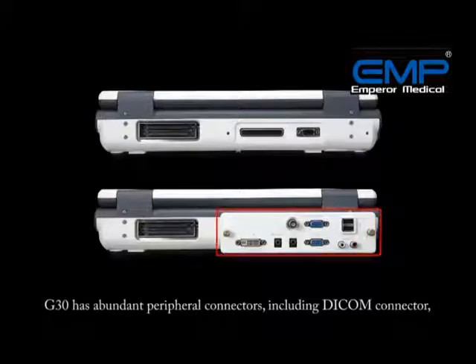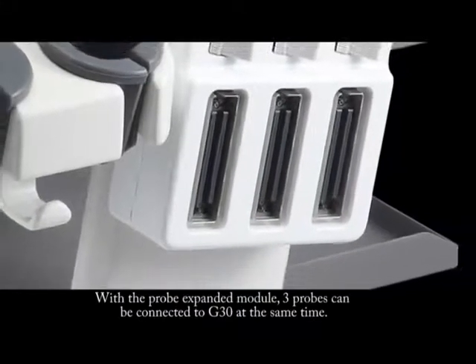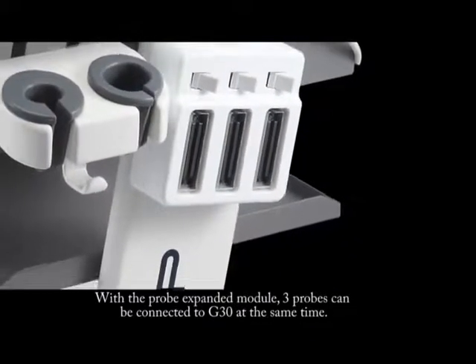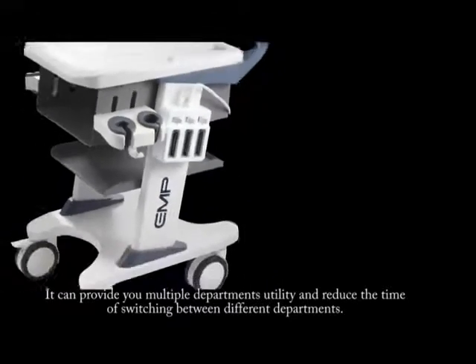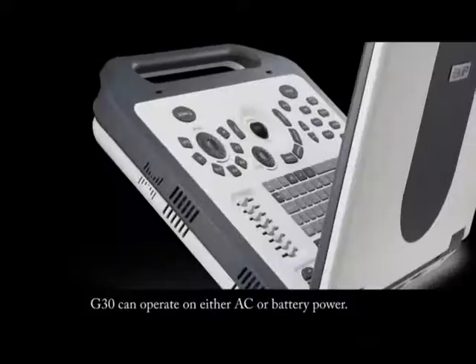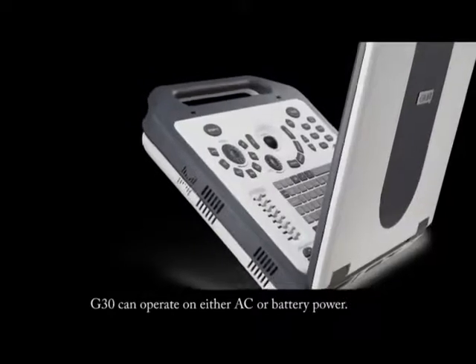The G30 has abundant peripheral connectors, including a DICOM connector, USB connectors, S-video connector, and VGA connectors. With the Probe Expand module, three probes can be connected to the G30 at the same time, providing multiple department utility and reducing the time of switching between departments. The G30 can operate on either AC or battery power.